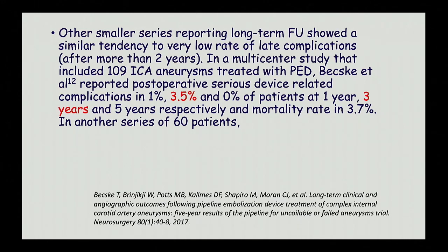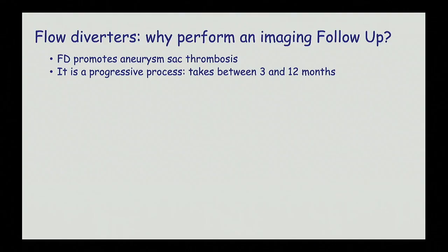and possibly to adapt our treatment to what we see. So why do we want to perform an imaging follow-up? Because flow diverter is working by promoting the thrombosis in the sac, and this is a progressive process, as you know. It takes between 3 and 12 months.